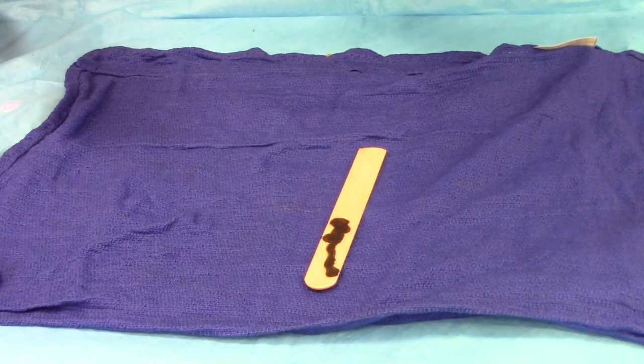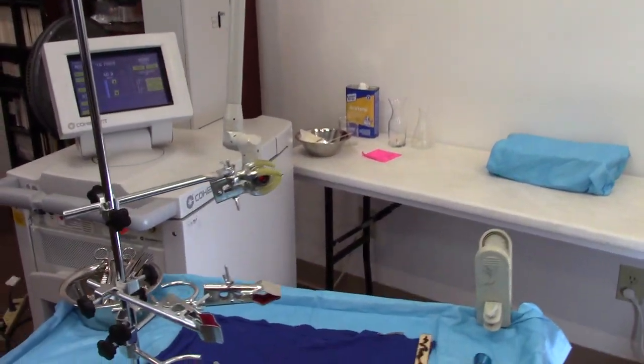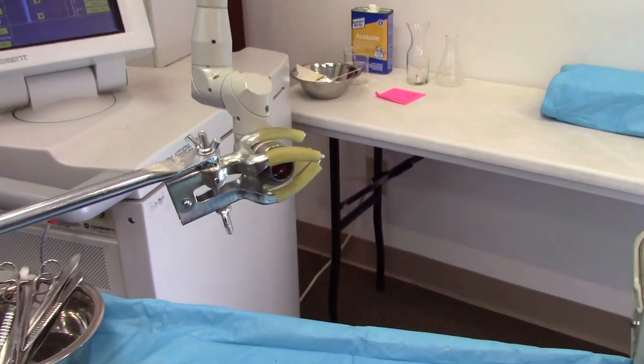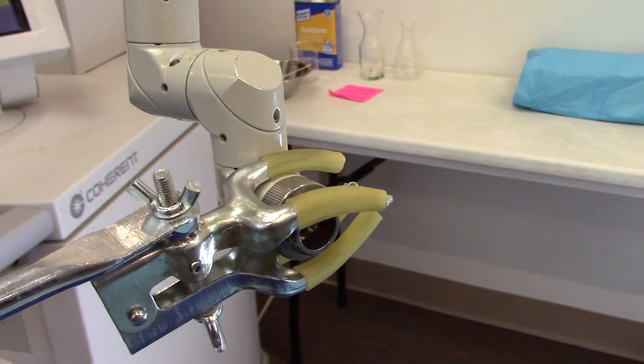Now let's try that across the room. Here you can see the setup — I've got the handpiece off of the articulated arm and I have it fixed in a mount so that I can shoot this across the room.